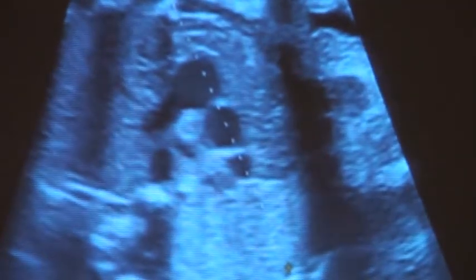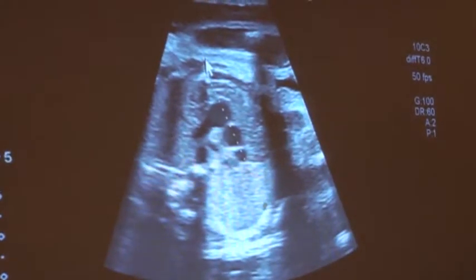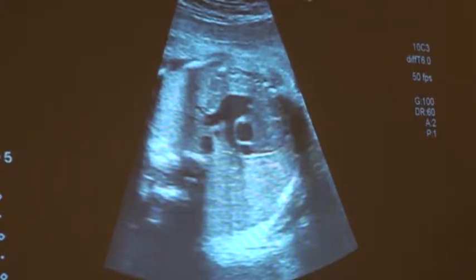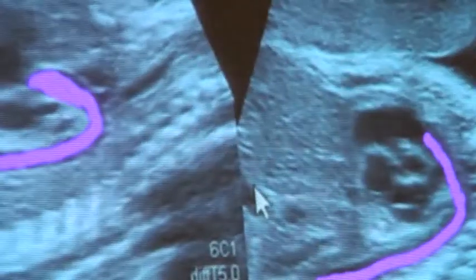And this is what I was talking about. You draw an imaginary dotted line to check the alignment of the PA, aorta, and SVC. If they are in alignment, then you measure from inner to inner, inner to inner, inner to inner. Whatever the pulmonary artery is, the aorta should be 1 millimeter less, and the SVC should be half of the pulmonary artery. If you see a beautiful fishtail sign, I call it a fishtail sign, you're dealing with the pulmonary artery, because that's a fishtail sign, and that is where you draw a line of that.